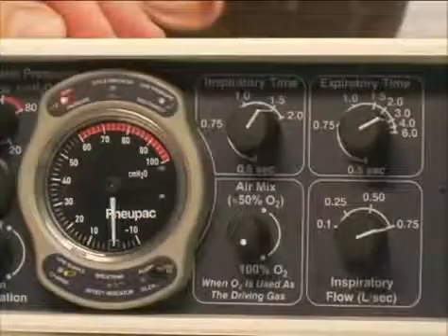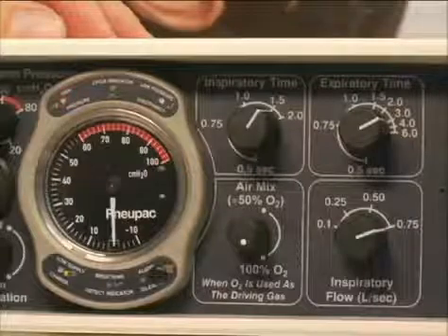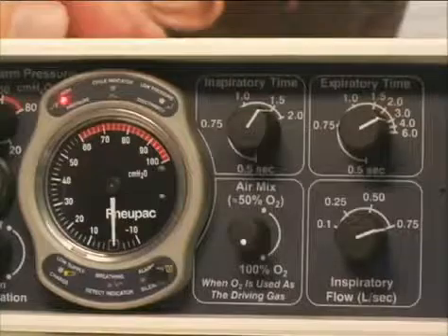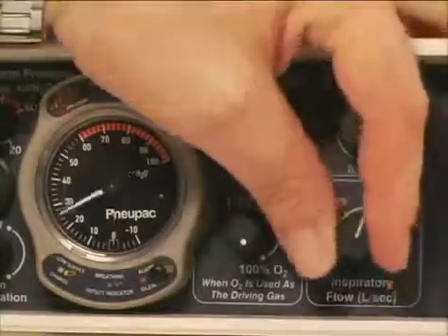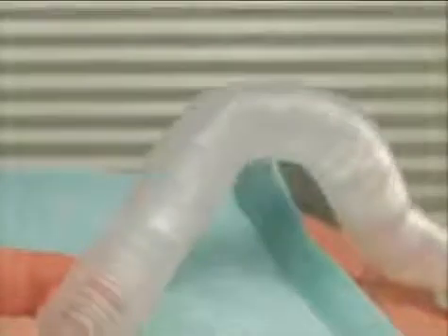If pressure jumps excessively when inspiration begins, the cause may be an airway obstruction, which you must clear. If the airway is not blocked, the inspiratory flow may be too high and need to be reduced. Higher pressure is normal when you ventilate using an endotracheal tube. But if pressure becomes abnormally high, check for kinking of the tube or excessive ventilation.